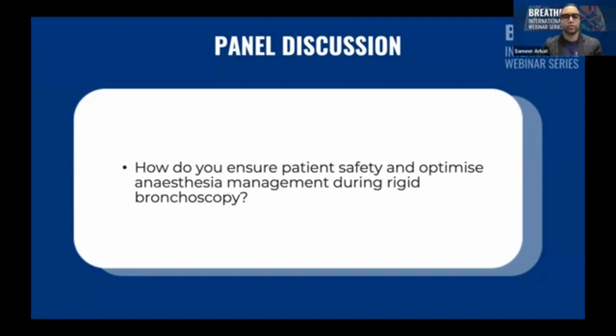Okay, so that was a very detailed explanation from Dr. Vishwas, and we got to know different points of view from Dr. Shyam and Dr. Vishwas. I would like to put in a concise note that what is most important is a very thorough pre-procedure evaluation from the anesthesia point of view. Your communication with your anesthetist is of utmost importance, and so is how comfortable you are with emergency intubation techniques, in case there is a change in your plan of treatment modality while doing rigid bronchoscopy.